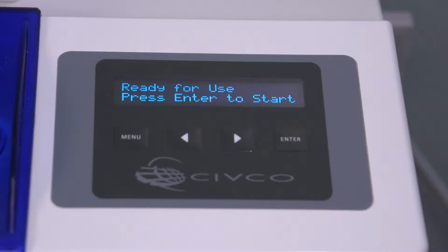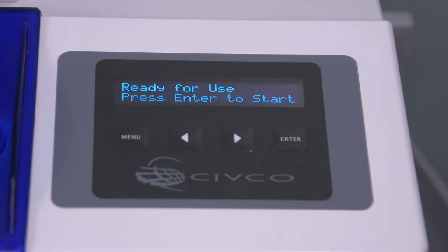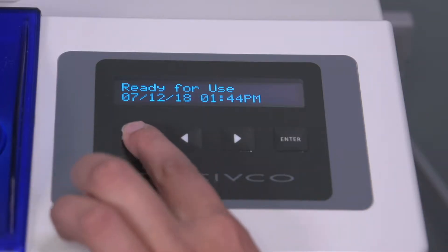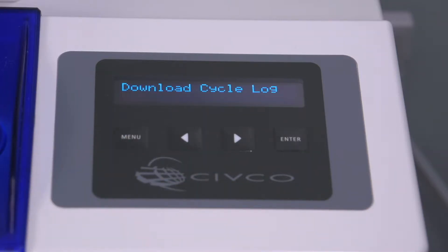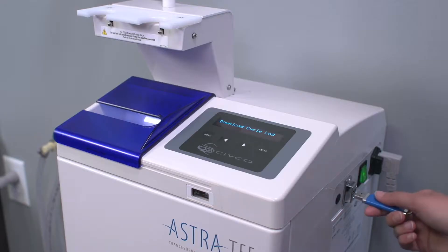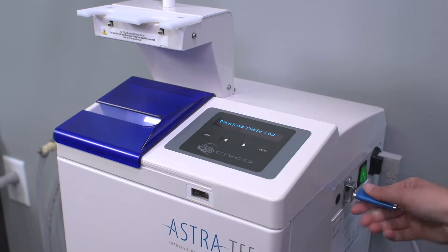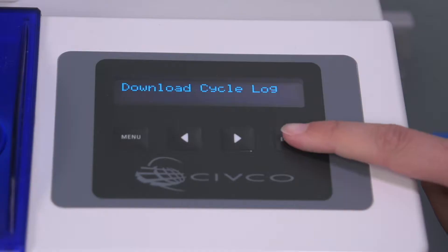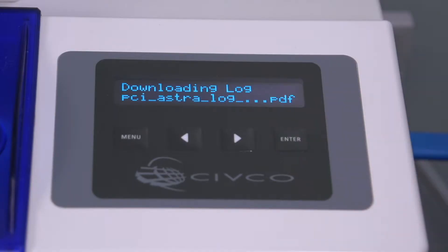To download the cycle log, press the menu button. The screen will say 'download cycle log.' Insert a flash drive into the USB port on the side and press enter.